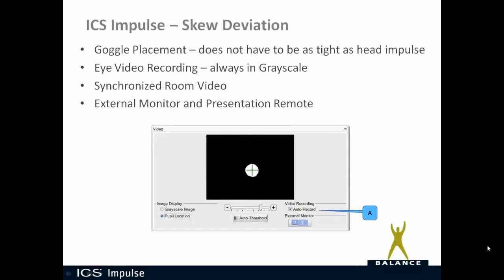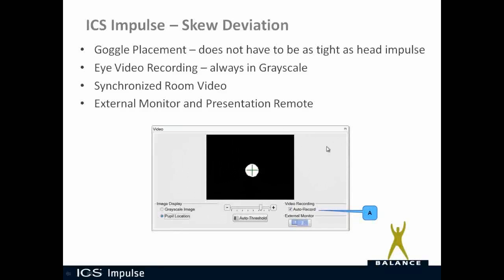Eye video recording: whether you choose to threshold the pupil, make sure pupil tracking is working appropriately by using pupil location or grayscale image. Just note that when the eye is being recorded, it is always being recorded in grayscale.